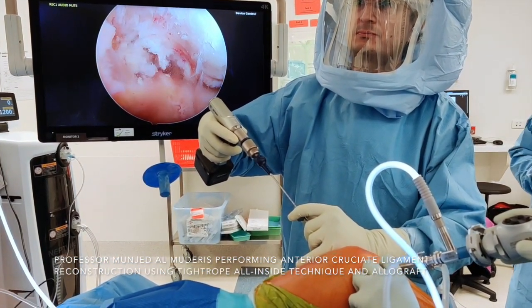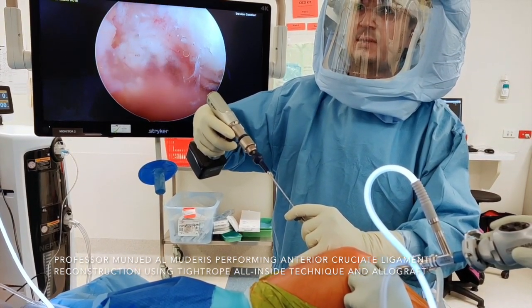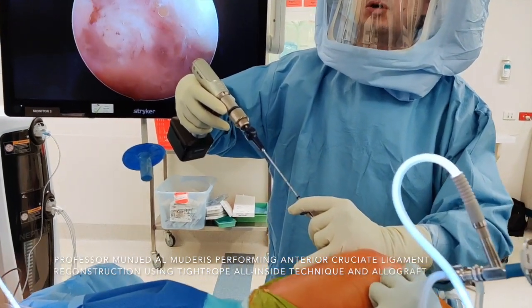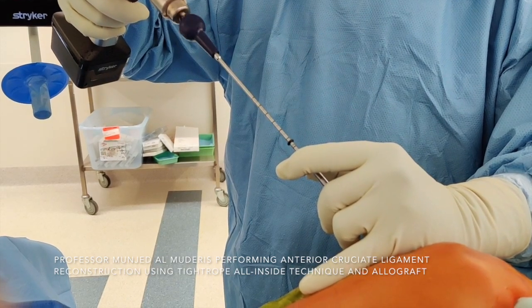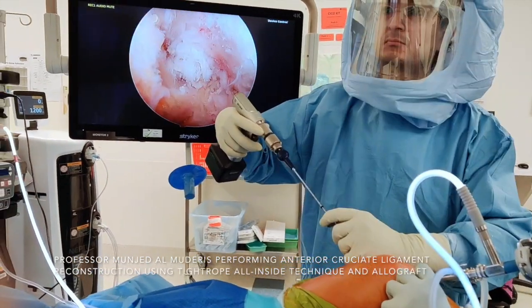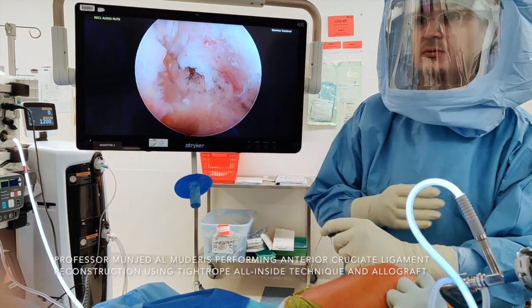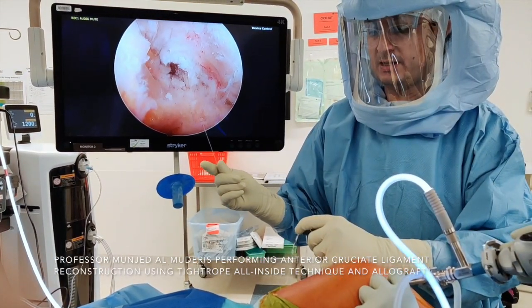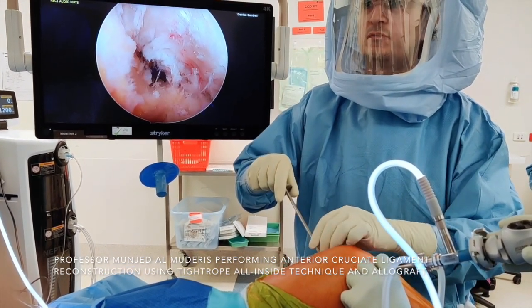I drill backwards in forward revolution of the drill. I stop at the forward junction of the drill with the flip cutter. We measure on the graft two and a half centimeters, so I drill two and a half to three centimeters. I remove the flip cutter after unclipping it, and then insert a passing wire going from outside to the inside. I remove the trocar.